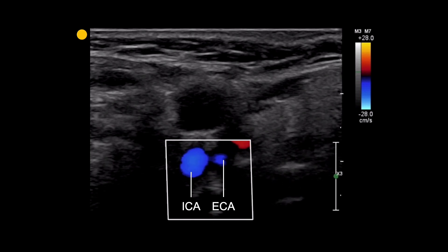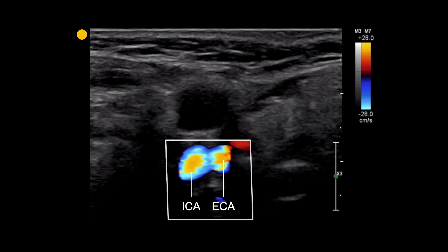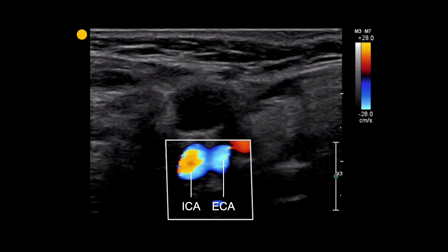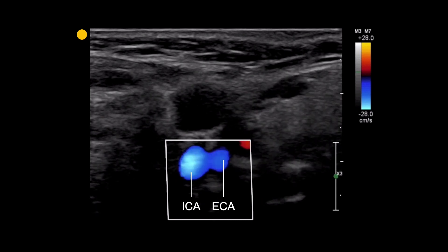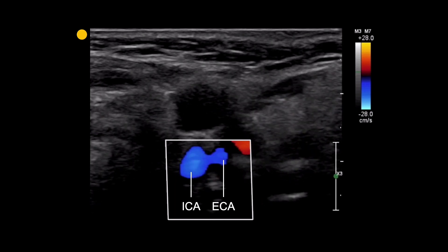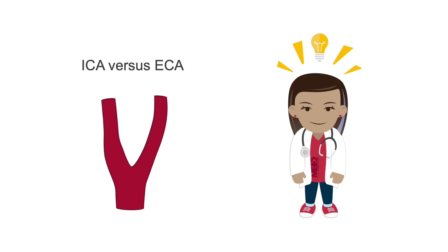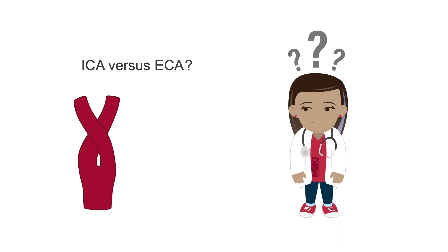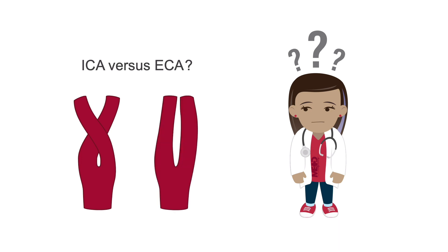It is important to note that this video has been slowed down to more clearly show these differences — it will appear about twice as fast when assessing a patient. Remembering these key differences will help you clearly identify the ICA and ECA in most cases, but sometimes distinguishing between these two arteries is more difficult, because the orientation of the vessel may be different, or the arteries might be very close together, with minimal difference in the size or flow patterns.